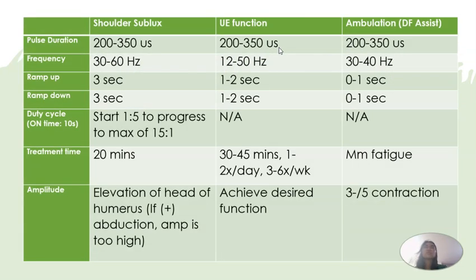Okay, so this is for your FES. These are the summary for FES. Now let's go to ES. Wait lang. Before we go to ES, shoulder subluxation, review lang natin ng konti.